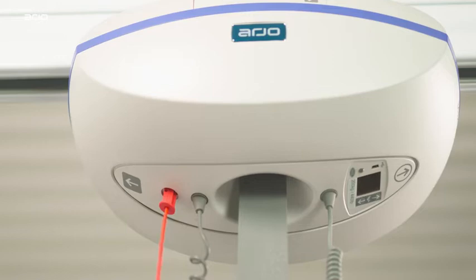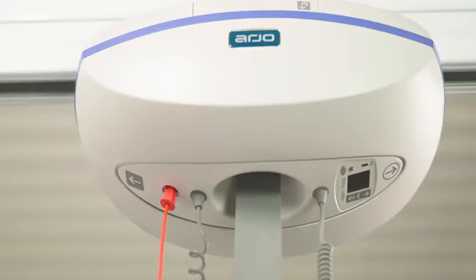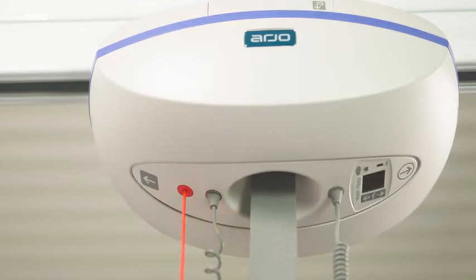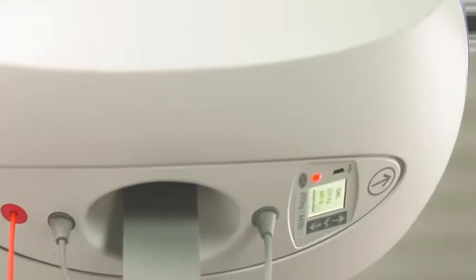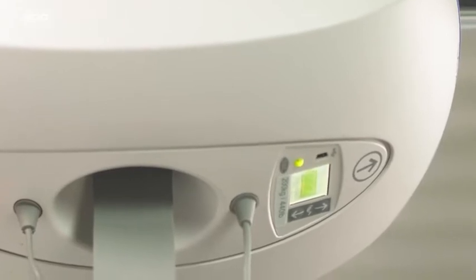The display and all indicators shut off. A small red plastic insert comes out of the casing. To reactivate the lift, push up on the red plastic insert. The lift is ready to use when the battery symbol or icon appears on the display.